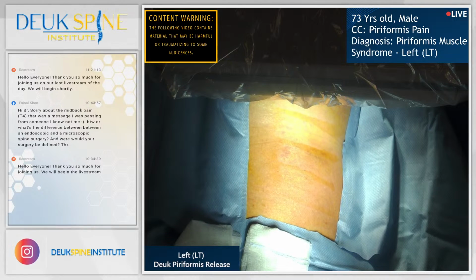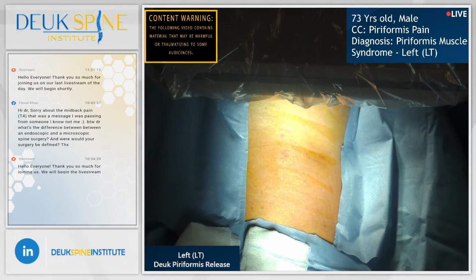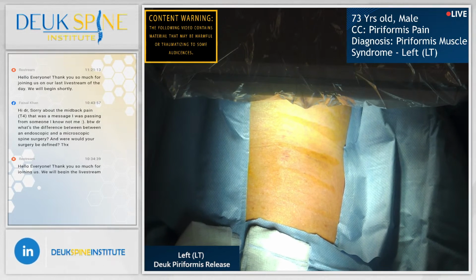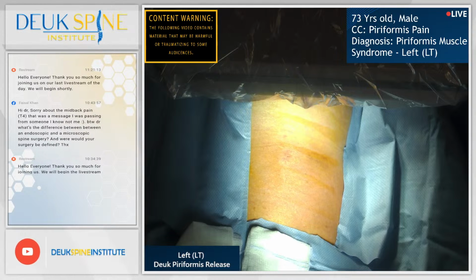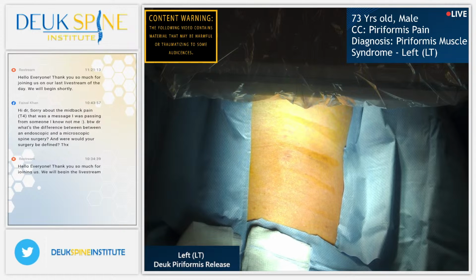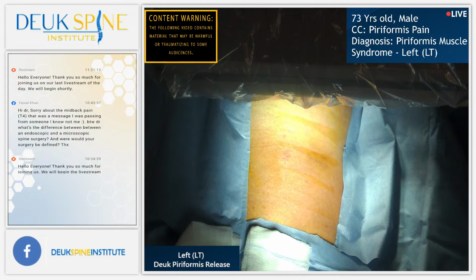Our patient's from Florida. You can see from the x-ray he's had an artificial hip put in. To have that artificial hip put in, they put a huge metal shaft down into his femur, and then they connect it to a little ball head and a socket that's made out of metal. Now, when the surgeons do this procedure, they do not release the piriformis muscle, and this patient has, I believe, piriformis muscle pain that's going down his left leg.